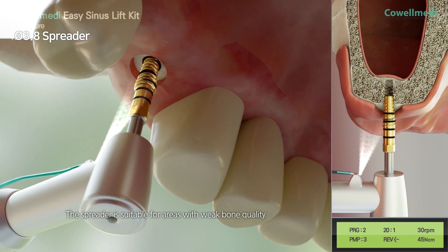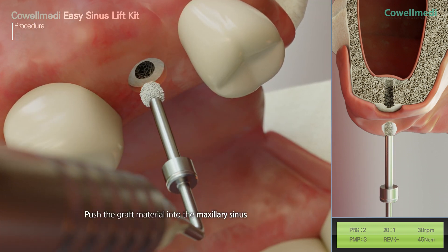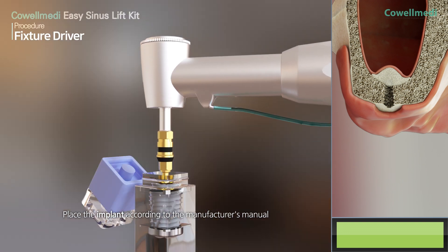The spreader is suitable for areas with weak bone quality. Place the bone graft material in the drilled area, then push the graft material into the maxillary sinus. Place the implant according to the manufacturer's manual.